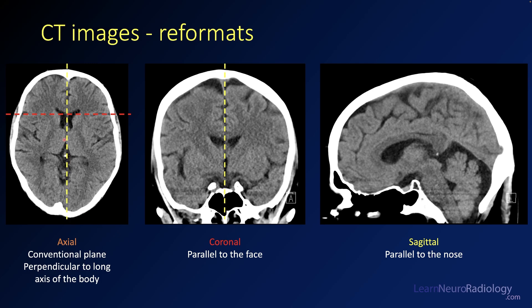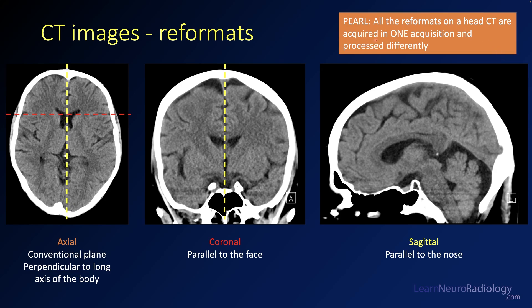The sagittal plane, shown by the yellow dashed line, is like cutting down the middle — parallel to the nose. In the sagittal image you can see the corpus callosum and the ventricles. Each plane has its relative strengths and can give you different information. On CT scanners, these are not obtained separately — they're just reconstructed from the original data acquired in one scan. All reformats on a head CT are acquired in one acquisition and processed into these different planes to help with interpretation.